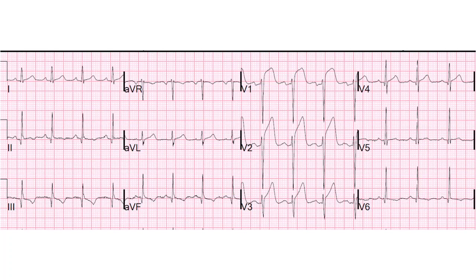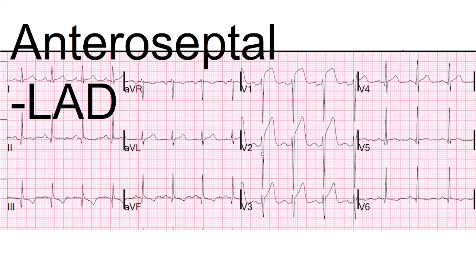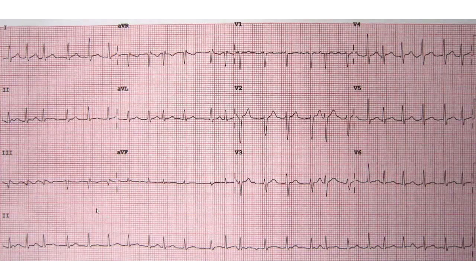This is an anteroseptal MI. Septal-anterior for V1, V2, V3 — we can see considerable ST segment elevation in all three. One noteworthy part of this EKG is the T-wave inversion in lead three and AVF, indicating ischemia in the inferior wall. This is absolutely not out of the question because all three major coronary arteries do terminate in the inferior wall. If we have a blockage and injury in the anterior region, it's certainly credible to see ischemia in the inferior wall, since the other vessels don't cover identical anatomy.